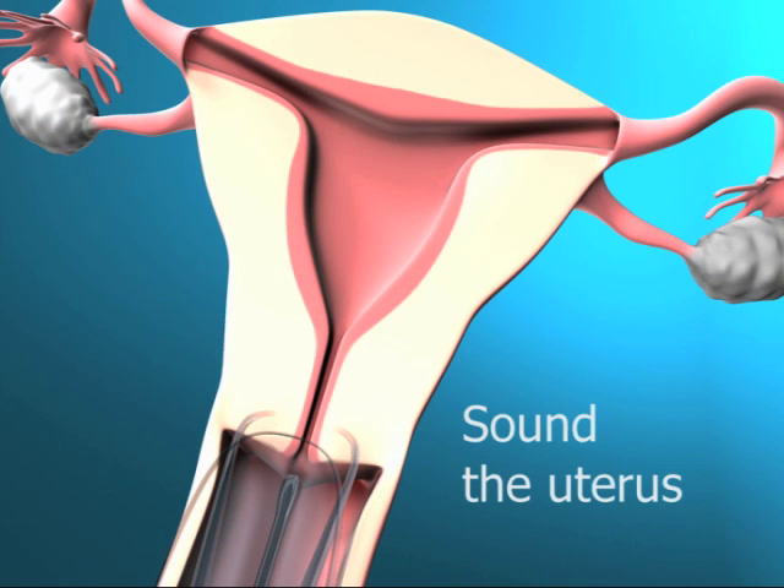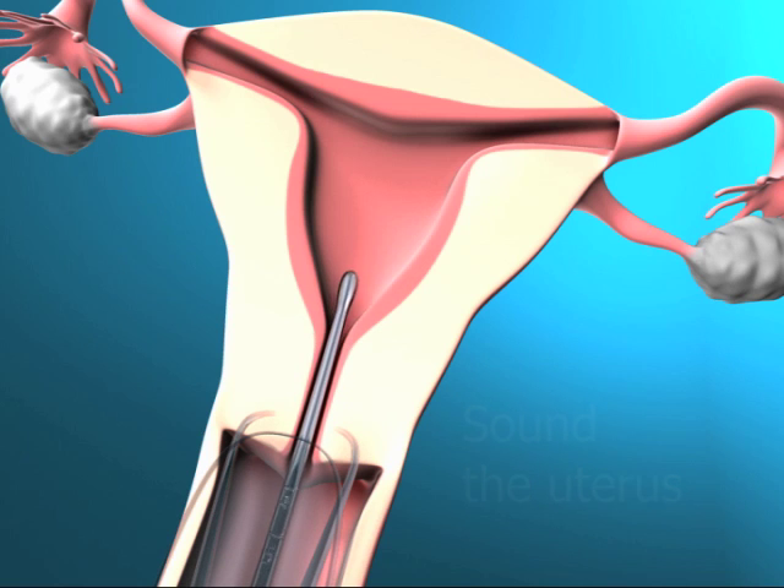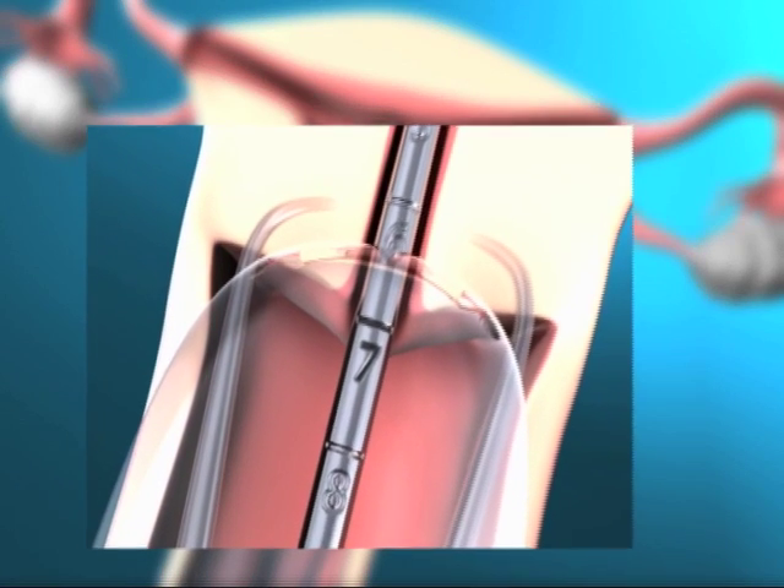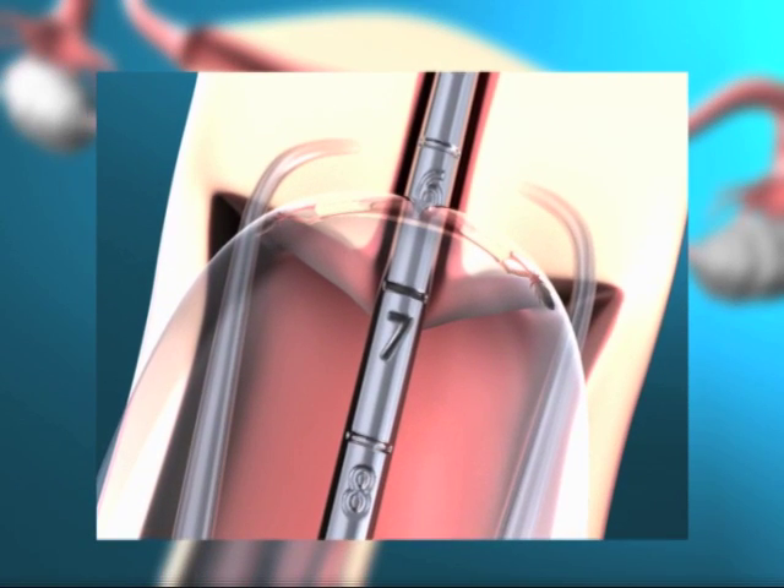Advance the uterine sound through the cervical canal to the fundus to measure the depth and confirm the direction of the uterine cavity. If difficulty is encountered, consider dilatation of the canal.